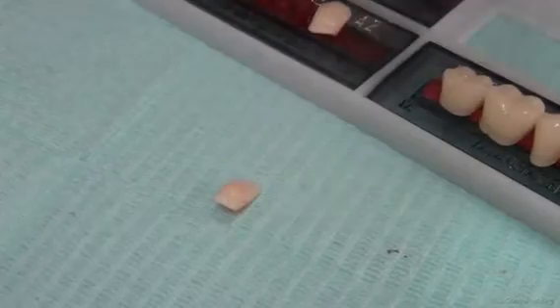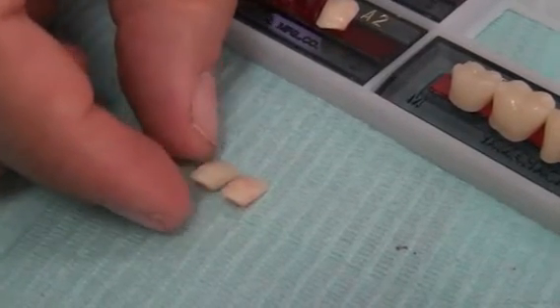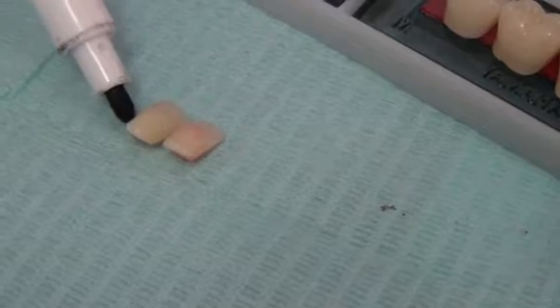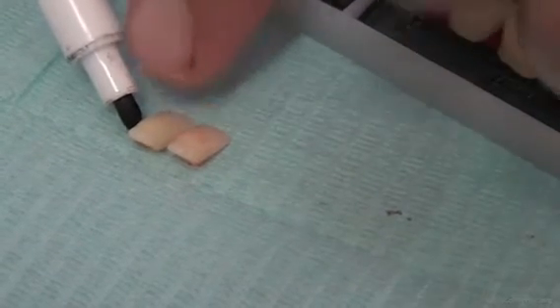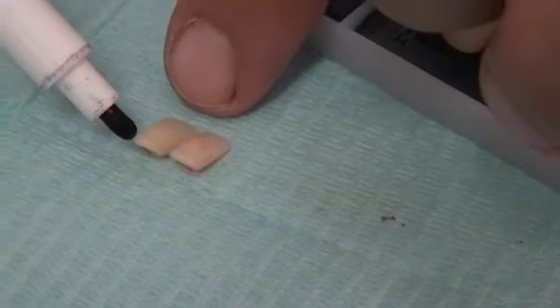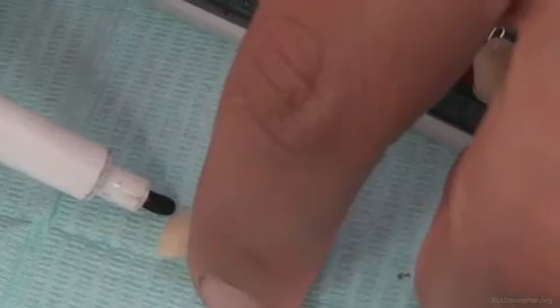If I'm going to put the lateral into location and I want the incisal edge straight with the central, I will not get it straight if I put it in this angulation. The teeth are designed so that if you put them in the correct angulation, they will automatically have an incisal edge straight. Okay, so our guide, different tooth molds have different morphologies, but the idea is that when I have the incisal edges straight, I will have the roots in the correct angulation. So this will determine the angulation of the tooth, having the roots divergent to a degree that is enough.